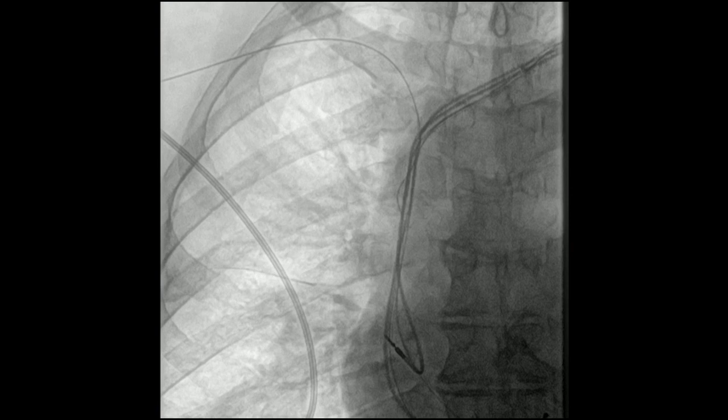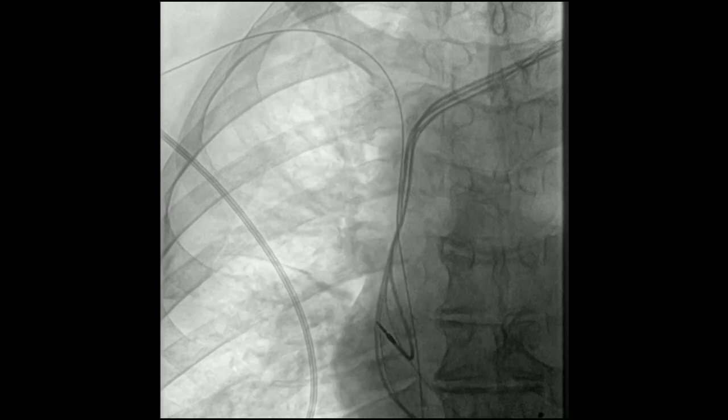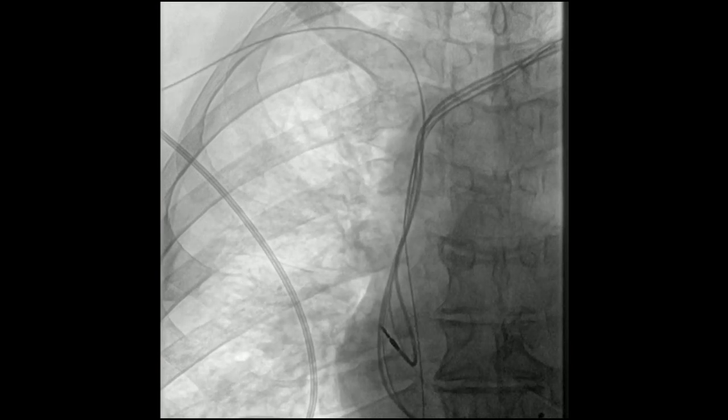What we're doing now is replacing the sheath and then advancing a catheter over that to steer the wire. And now you can see we've actually got the wire across it — it went across without even putting the sheath up there. That's a good sign in terms of being able to cross the occlusion.